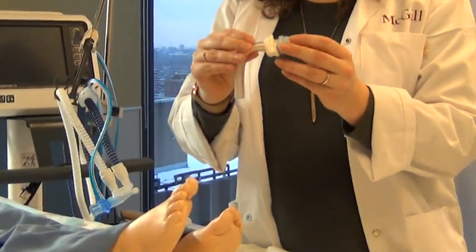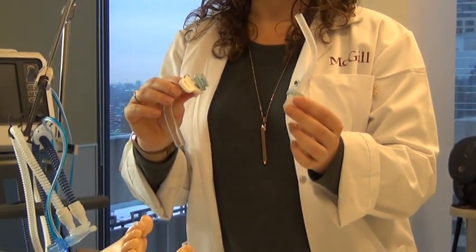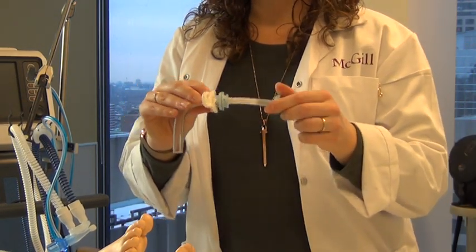You can also find a tracheostomy that has a disposable inner cannula. So this is a cannula that every time you clean the tracheostomy, you can dispose of and insert a brand new one.